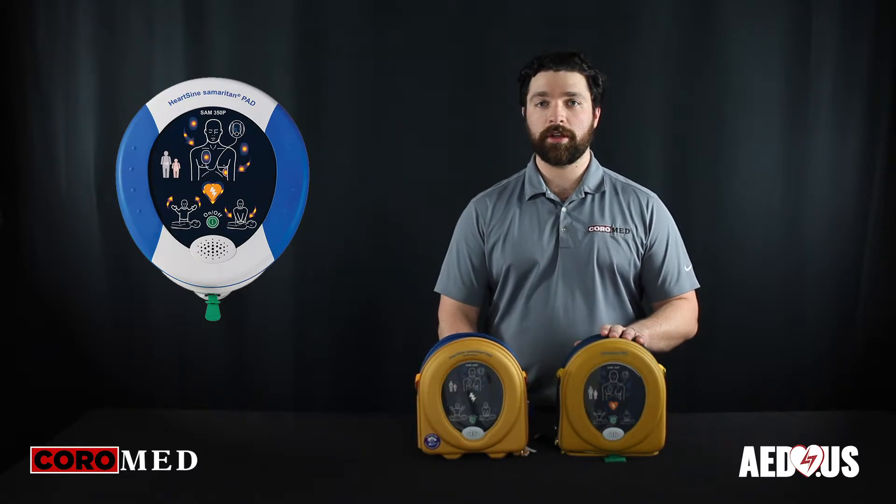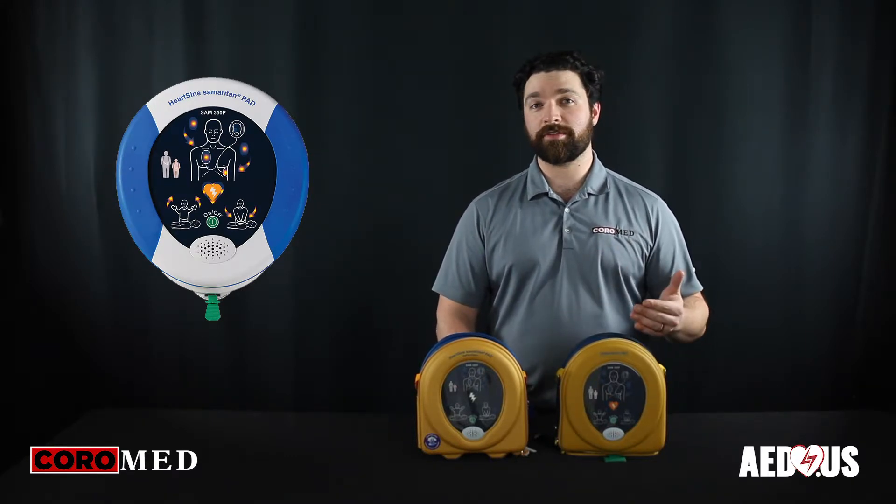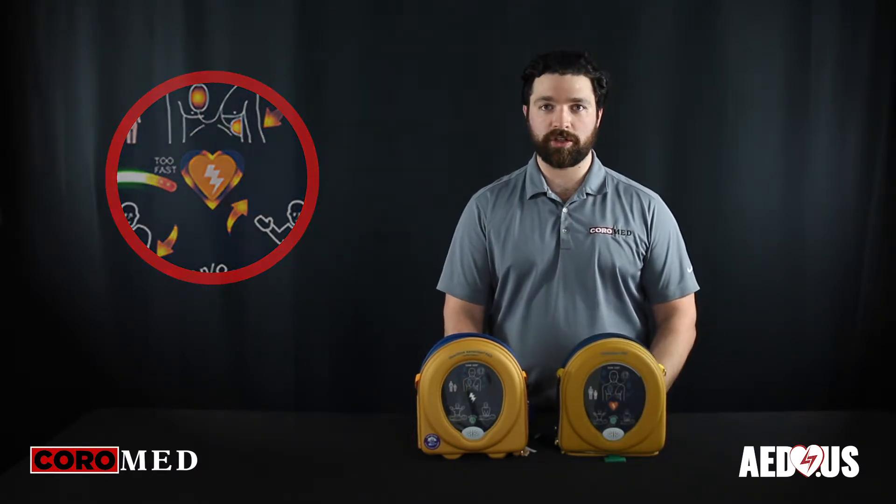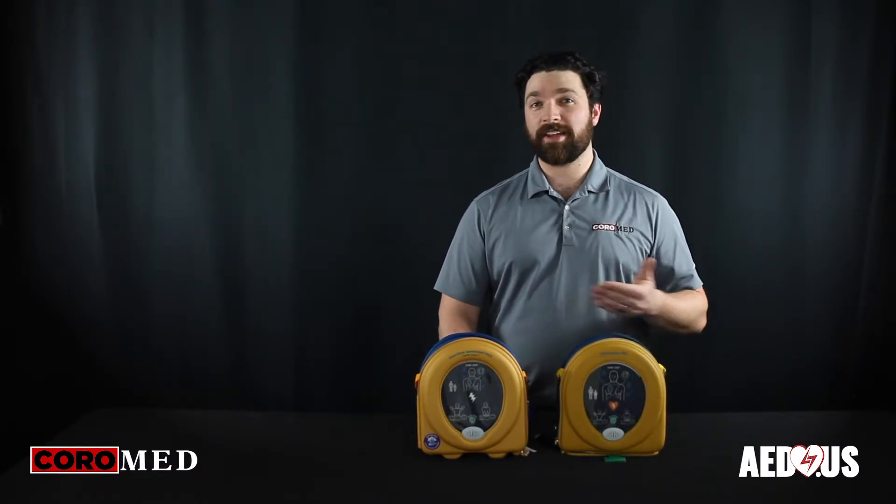One of the key differences is that the 350 is the semi-automatic version, meaning that if a shock is advised, there'll be a button light up that then has to be pressed to deliver the shock to the patient. This is an added safety step allowing the rescuer to make sure that no one is touching the patient and that the area is clear to deliver a shock.